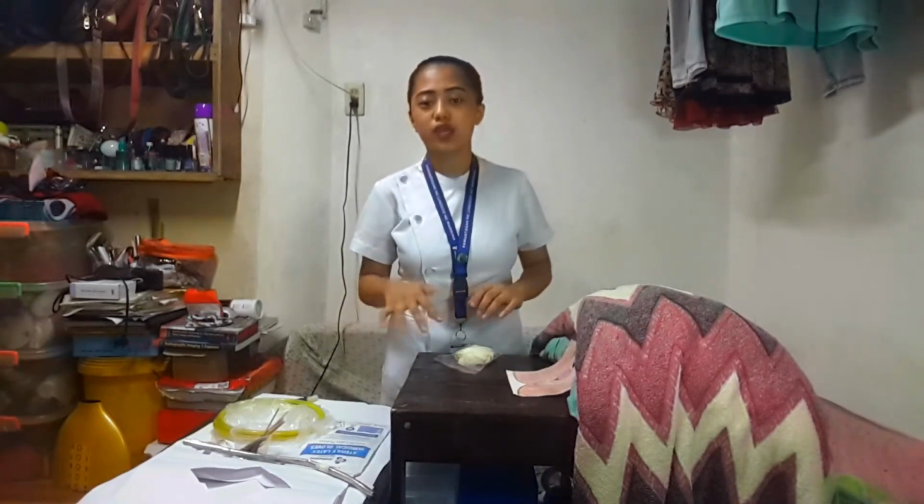The rationale for doing the female catheterization is to drain the urine from the bladder. It is mostly applied on patients who will undergo a surgical procedure, or those patients who are not able to eliminate by themselves.